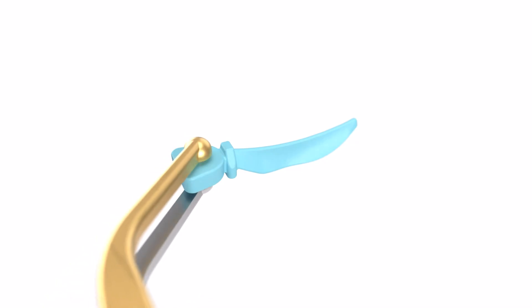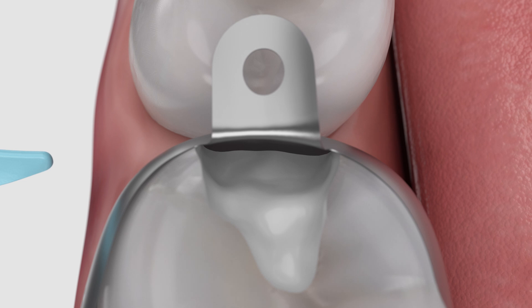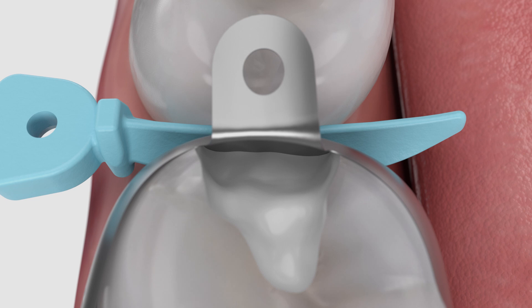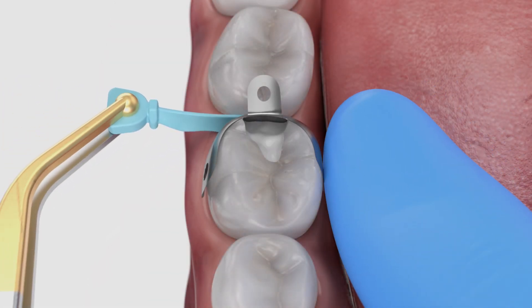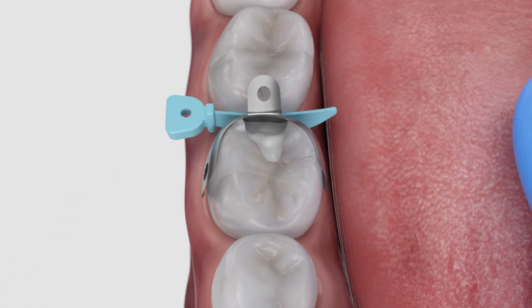Next, grip the hole at the end of the wedge. The adaptive self-guiding wedge facilitates easy placement by actually depressing gingival tissues and minimizing soft tissue trauma. During placement, trap the matrix tab against the adjacent tooth with finger pressure to prevent it from slipping as the wedge is placed.